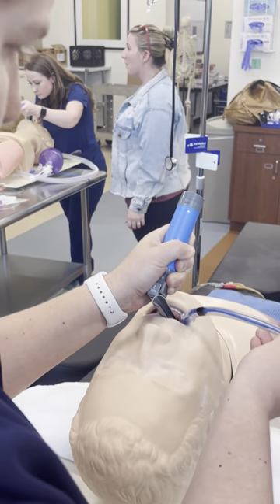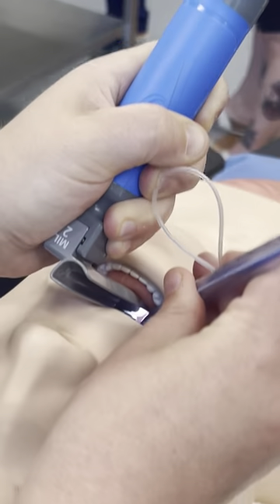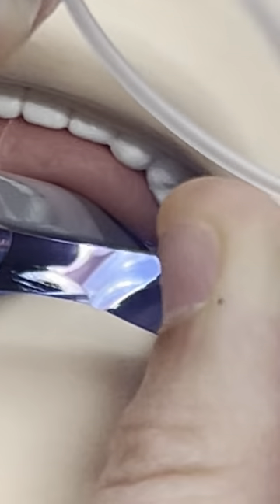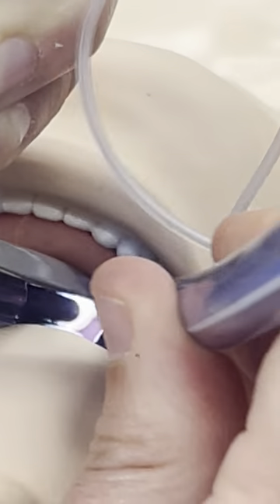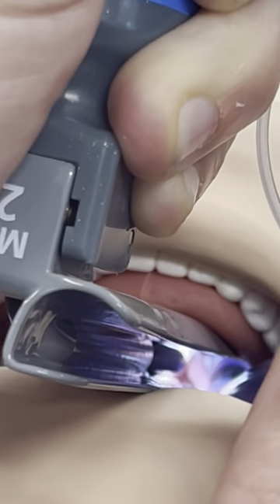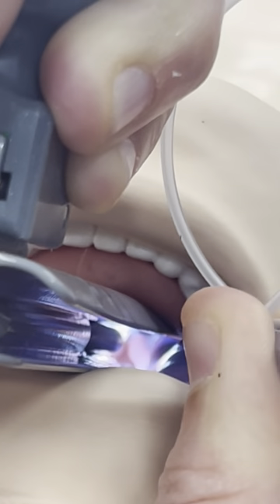Bring the corner of the tube in on this side. Can you see the black at all? I can see it looking. How about now? There it is — so there's the black portion. We're going to keep sliding.